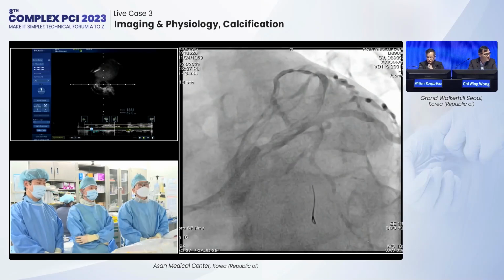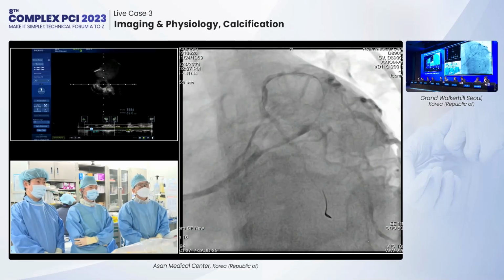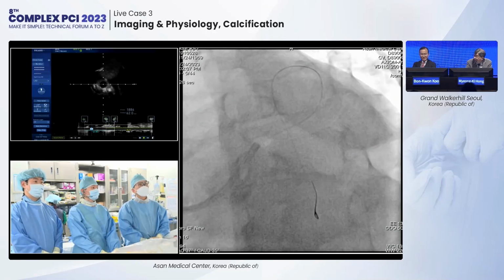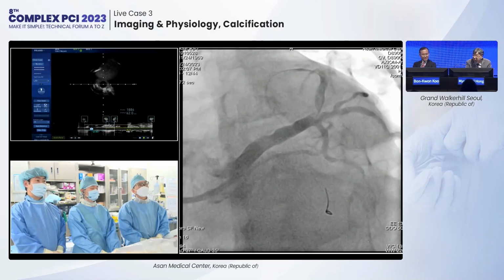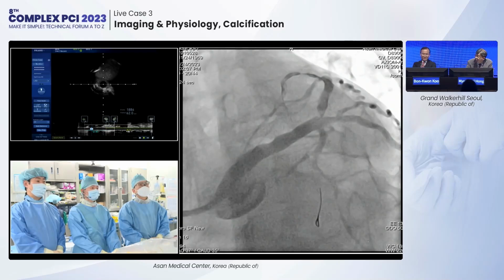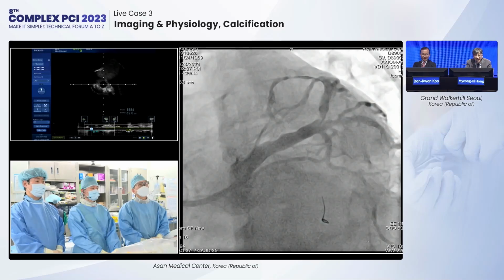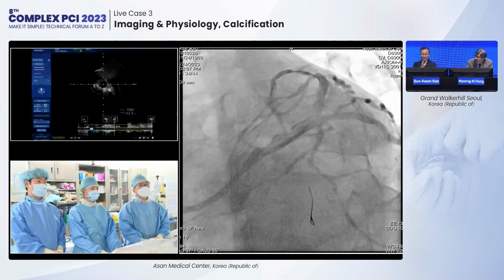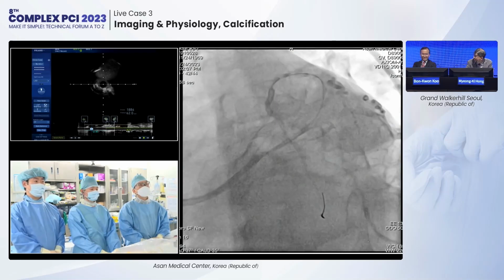For me, after the intravascular examination, I will fix it straightforward. The reason is that the basal proximal LAD is almost more than 5. My concern is not the presence of the calcium, but the size of the stent available for the proximal LAD, around 5. If I deploy a 5 stent, maybe the shape is somewhat eccentric. However, the final stent area is maybe bigger. So in this situation, maybe we need some debulking.